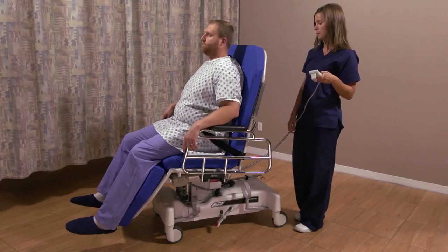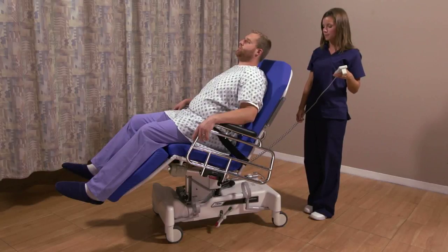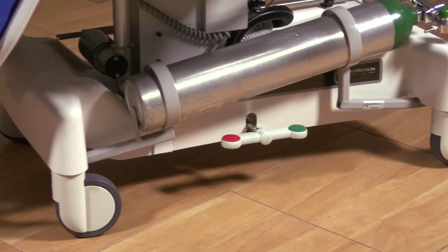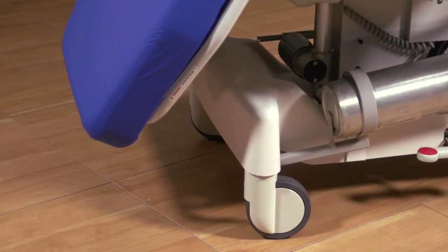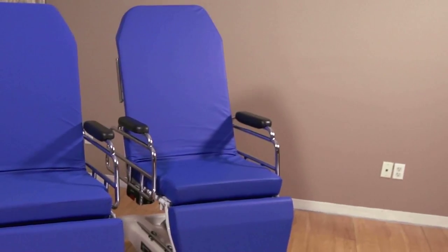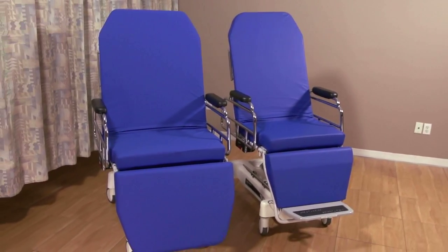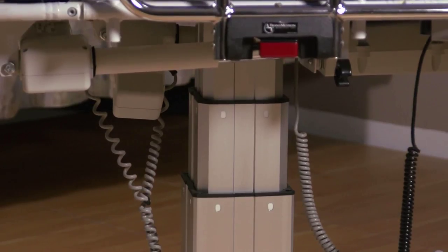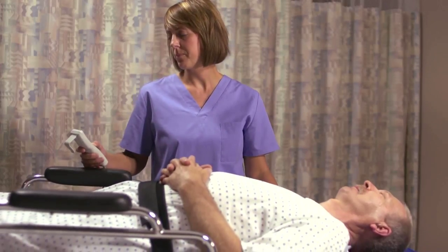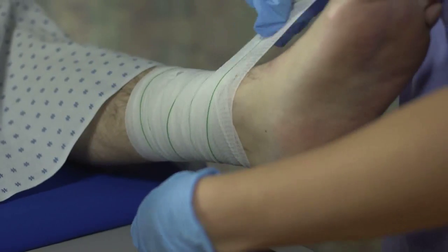There are many options and accessories that allow you to customize a chair for your specific needs. Your chair might have the X-option — the motorized seat tilt that raises the patient's knees, reclines the chair, and allows for pressure point relief. Chairs with the X-option have brakes located at the center of the base and the pendant has 10 buttons. A standard TransMotion Medical stretcher chair is 24 inches wide. The W option is 28 inches and can easily accommodate large patients. The T option has a triple column that raises your patient to an ergonomic height, allowing C-arm use in bronchoscopies and giving the physician convenient patient access for endoscopies and wound care. The Q option is an integrated scale that eliminates patient transfers for weigh-in in departments like emergency and dialysis.